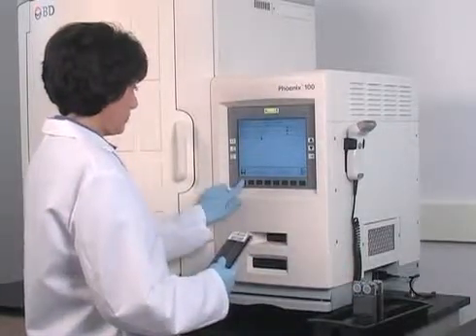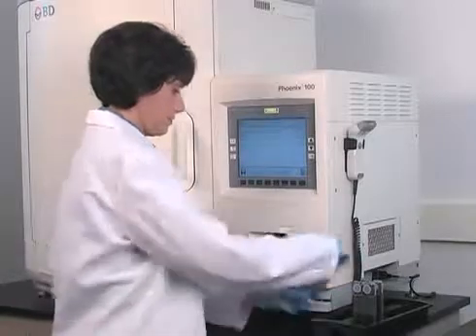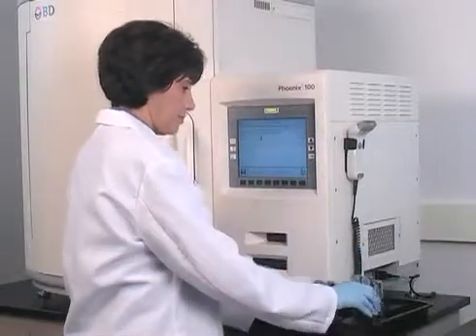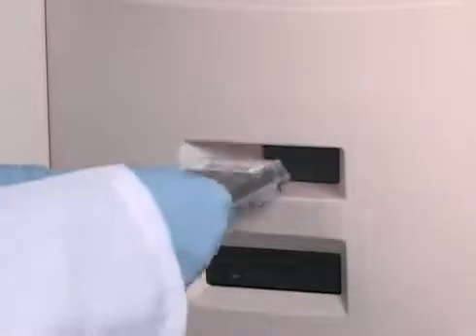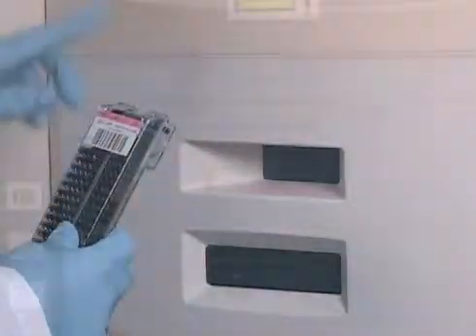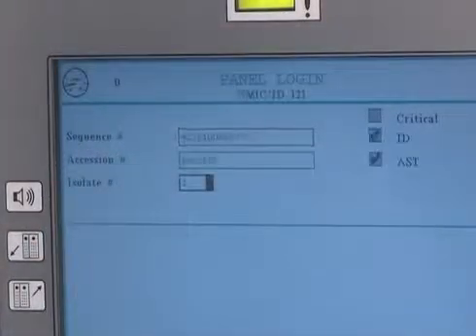Enter the login program and scan the sequence number of the panel. This procedure enters information about the panel into the instrument. Then enter or scan the laboratory accession number. The isolate number defaults to one but can accommodate up to 20 isolates.